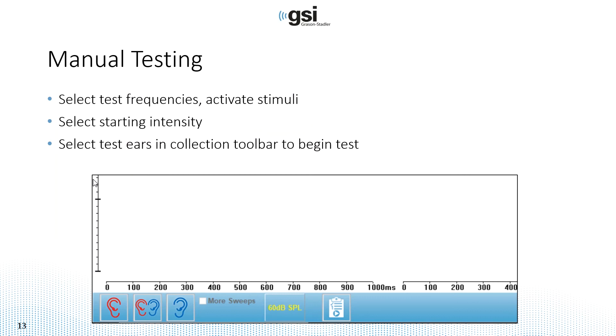For manual testing, you can simply select the test frequencies, activate the stimuli, select your starting intensity, and then to start the test, select right, both or left ear, whichever condition you want to test and then it will begin.